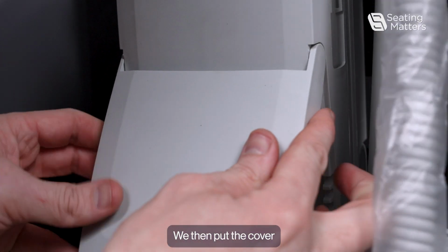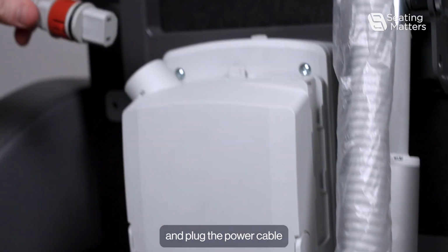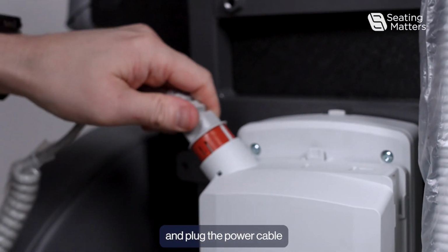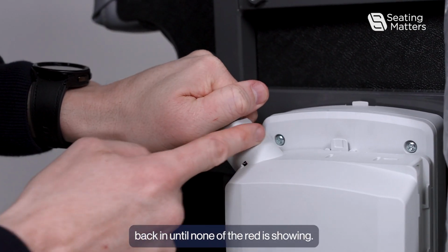We then put the cover back on and plug the power cable back in till none of the red is shown.